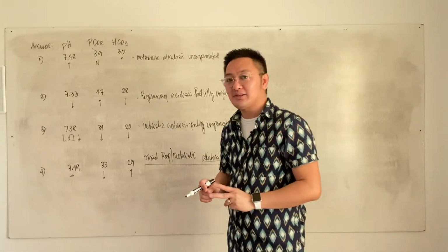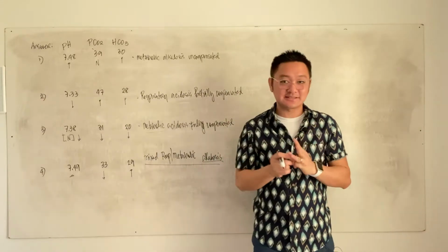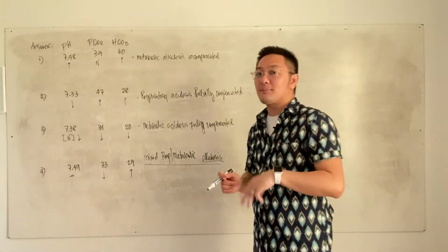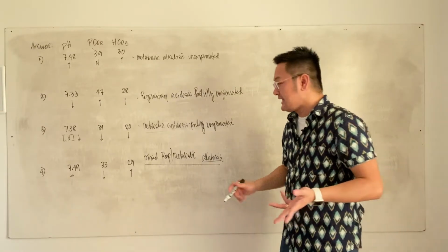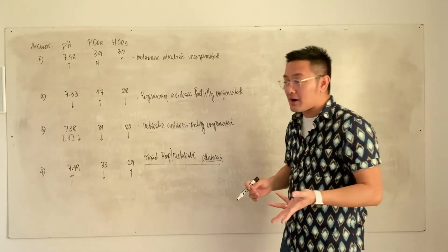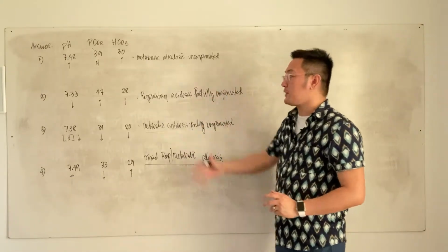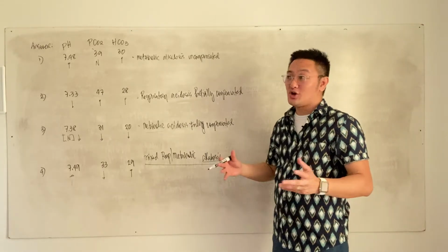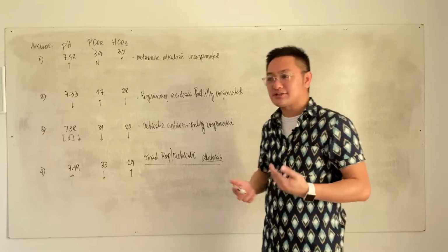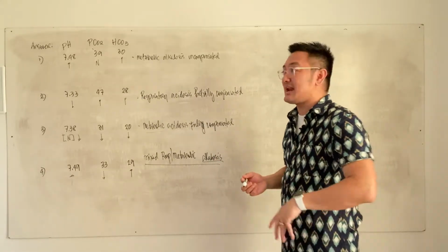After you're able to identify whether it's respiratory or metabolic, the third and last step is to classify whether it is uncompensated, partially compensated, or fully compensated. For this number 4, no such thing as fully or partially compensated because this is a mixed condition. Okay, so I hope you're able to get this correctly. If not, then go back to the previous video clip and try to analyze, understand, and absorb all the things that I said there.